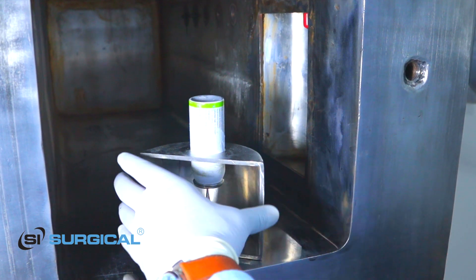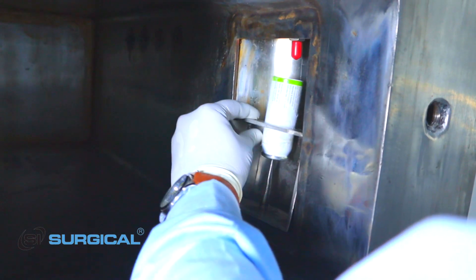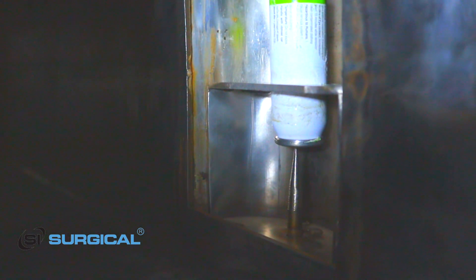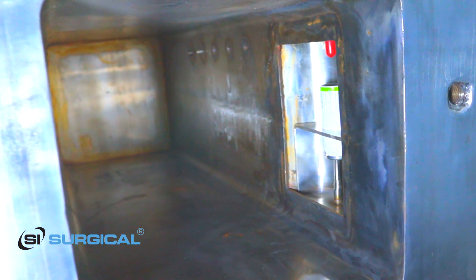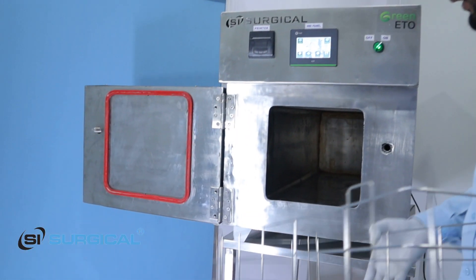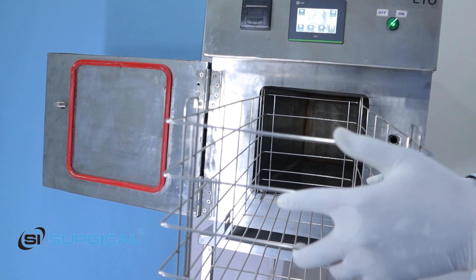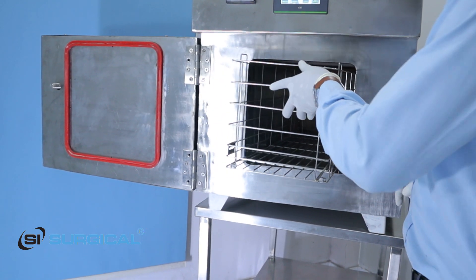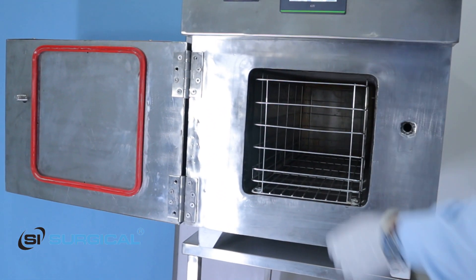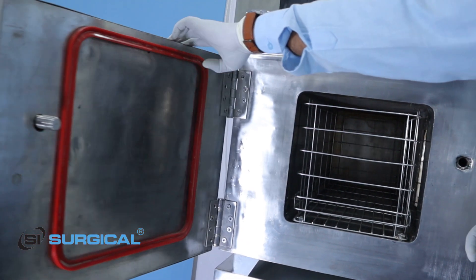We have to place this cartridge and cartridge holder here. After that we have to load this ETO basket at least 75% and then put it inside the chamber. Now you can see this is all set and we have to lock this gate.